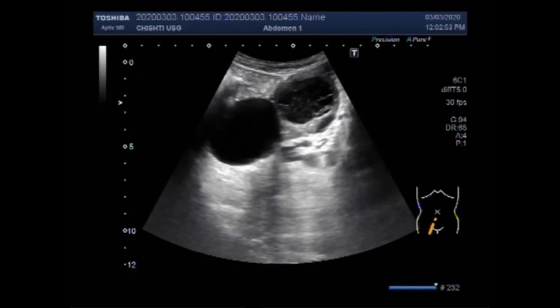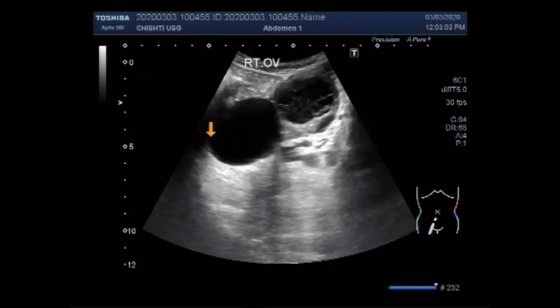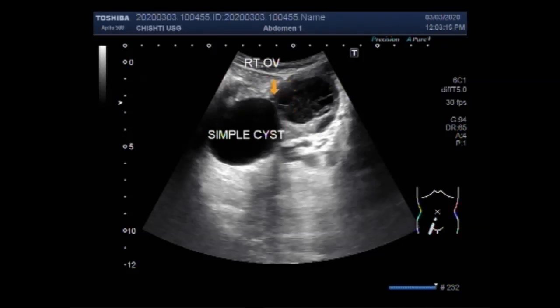During a woman's menstrual cycle, the egg grows in a sac situated in the ovary called a follicle. In most cases, the follicle breaks down and releases the egg. But if the follicle doesn't break open, the fluid inside can form a cyst in the ovary. You can see the simple ovarian cyst and the hemorrhagic ovarian cyst here.